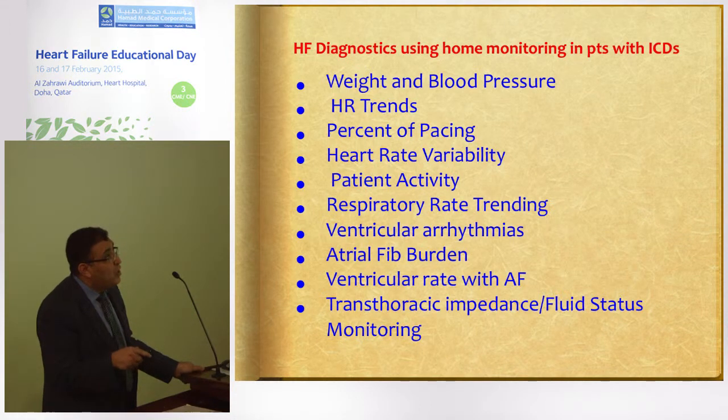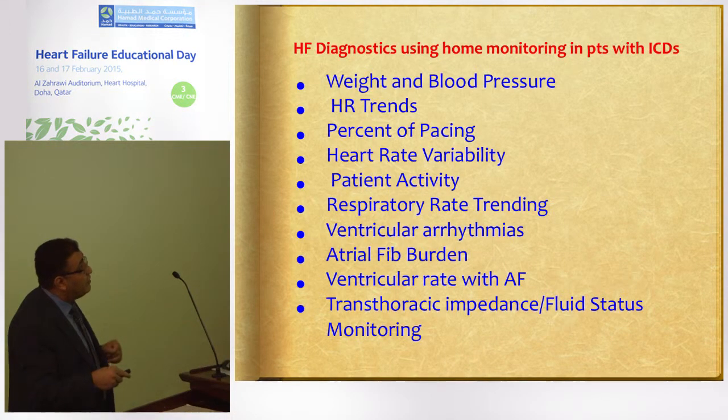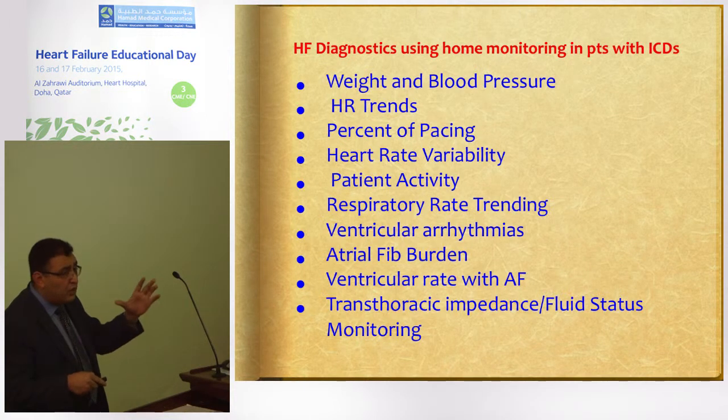So what features are we able to get from these patients? In addition to weight and blood pressure, which we could get from the patient himself, we could get heart rate trends, and this is important. We receive a report on these patients on a daily basis.